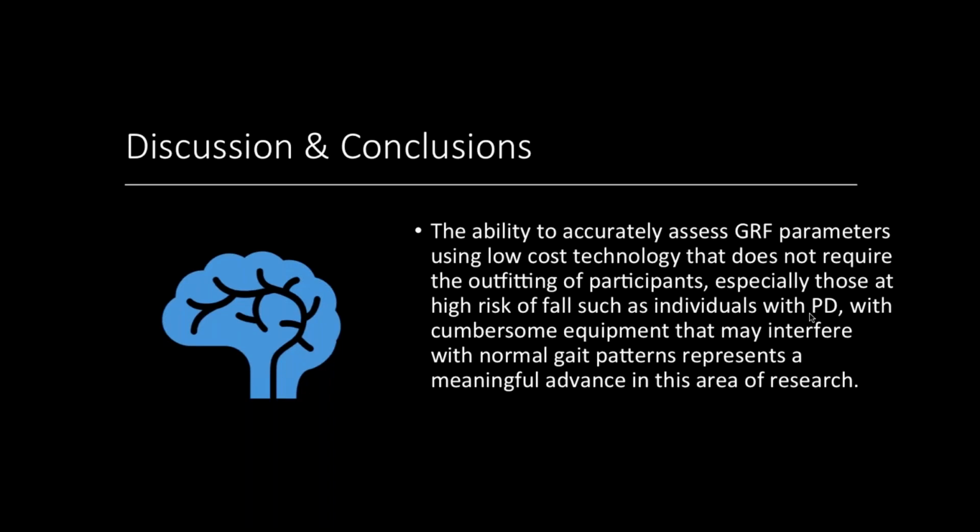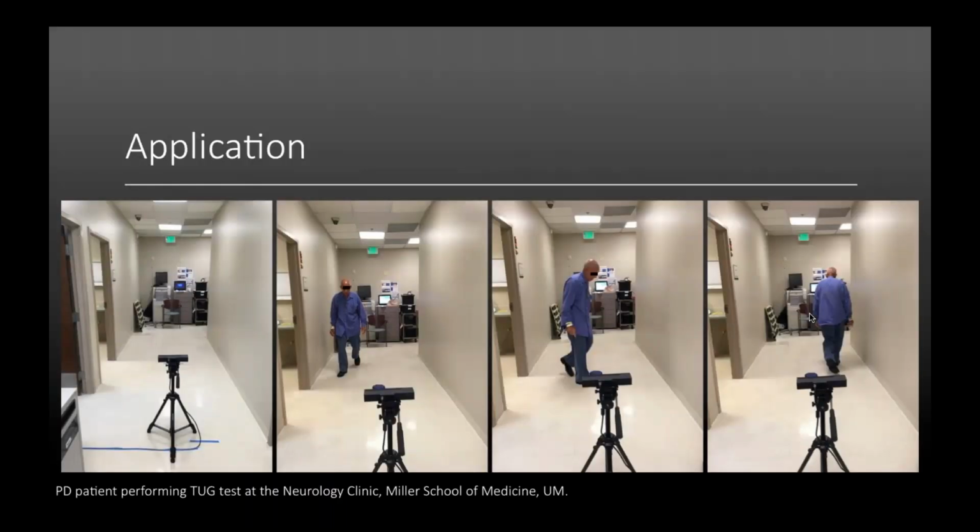So I just want to conclude by saying that the work we've done has been used in our Department of Neurology at the Miller School of Medicine. As you can see in the picture here, this is the Kinect used in one of the clinics in the hallway. And this is an actual PD patient.